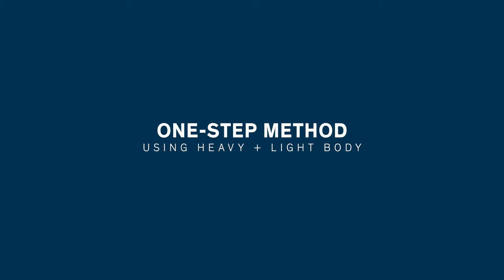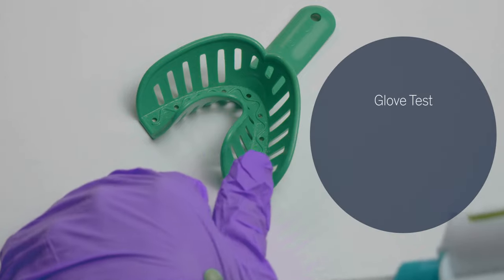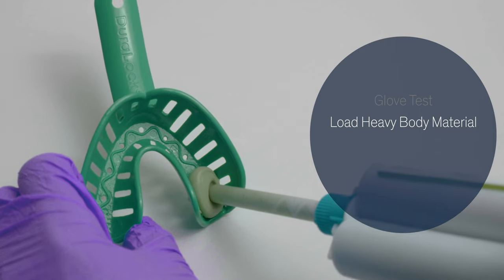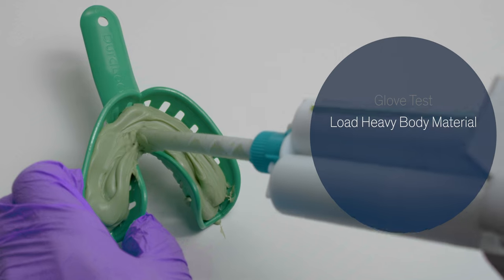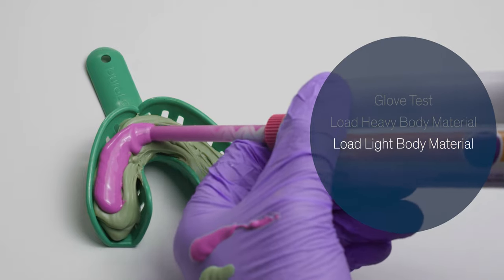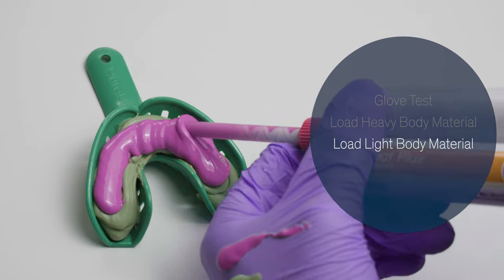Apply a little bit of heavy body that has been mixed to the back of your glove, then load PVS material into the tray starting at the very bottom of the tray, filling the tray three-fourths of the way to the top of the flanges. We can then move on to loading the remaining portion of the tray with the PVS light body material.